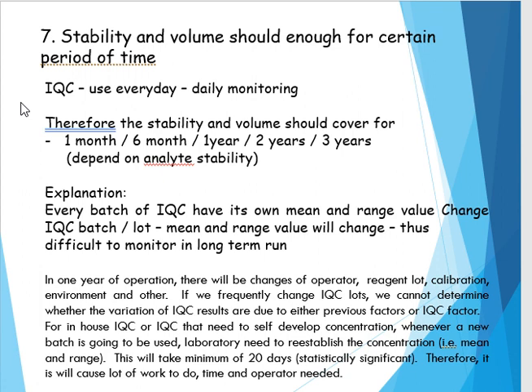And the last characteristic, the stability and volume should be enough for a certain period of time. Because QC is used every day for daily monitoring, therefore the stability and volume should cover 1 month, 6 months, or up to 3 years, depending on the analyte stability. Okay, it is because every batch of IQC has its own mean and range value. So if we change QC batch or lot, meaning that the mean and range value will change. Thus, it is difficult to monitor in a long-term run.